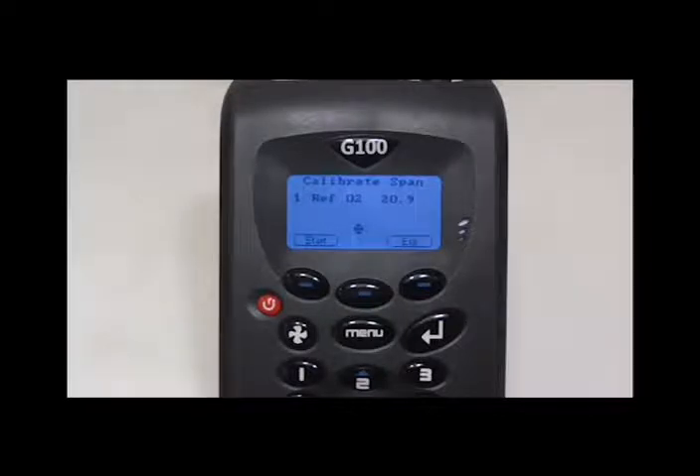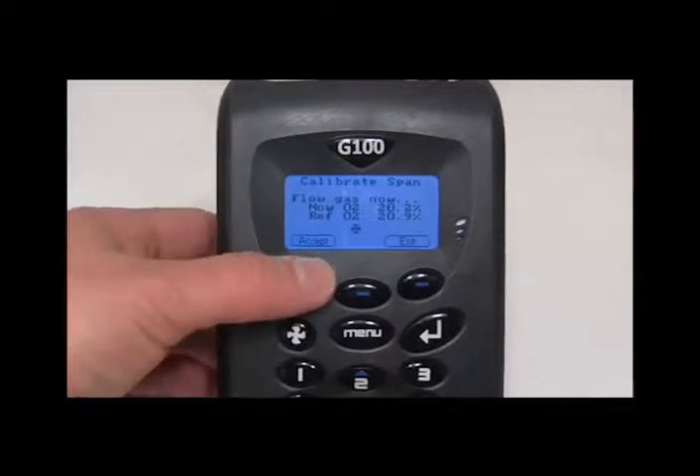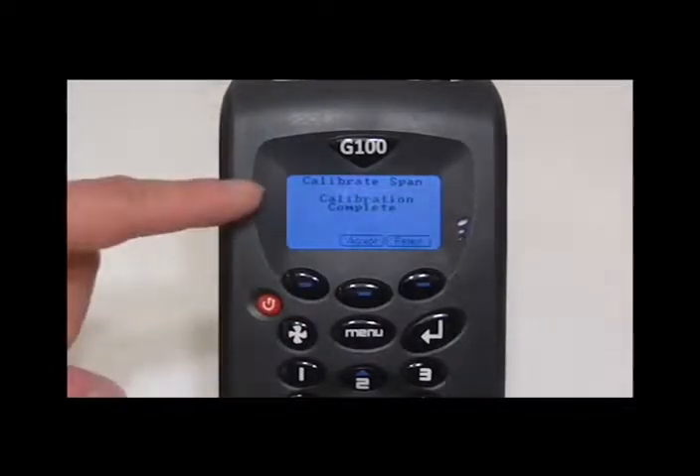Change the reference level to reflect your calibration gas, or 20.9 if you are doing it outside. Let the pump run before pressing start. Wait for the calibration to complete and exit back to the main reading screen.